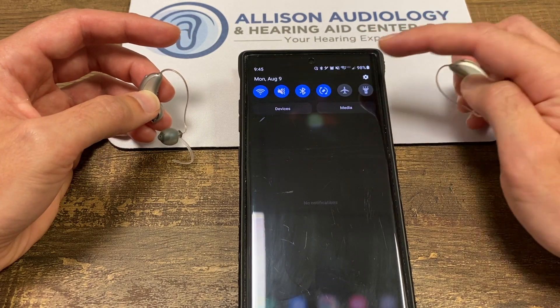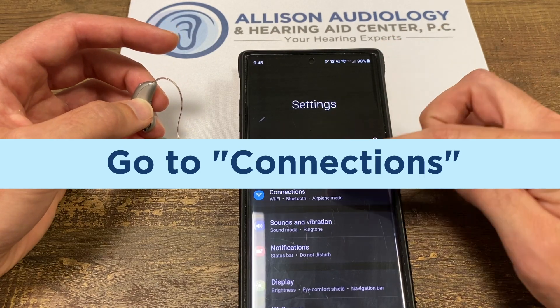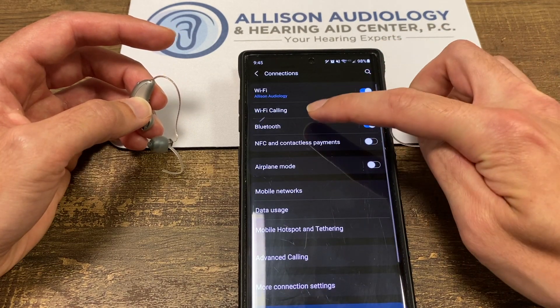We're going to go down to your settings. We're going to look for connections and Bluetooth.